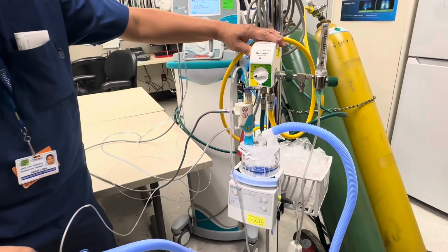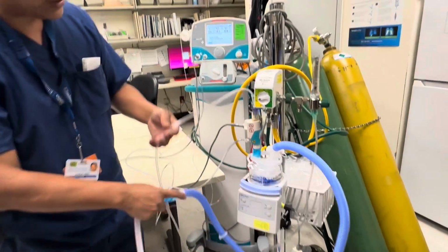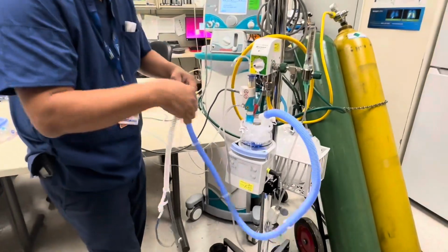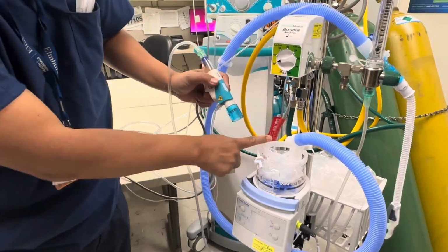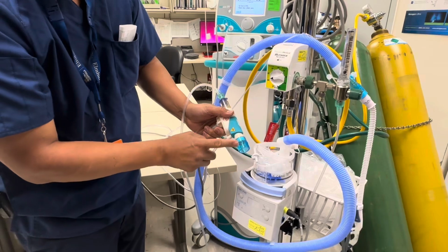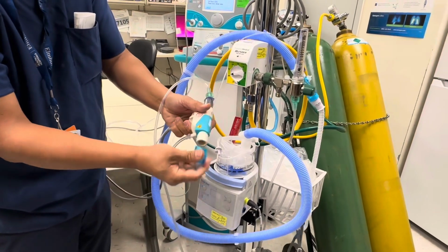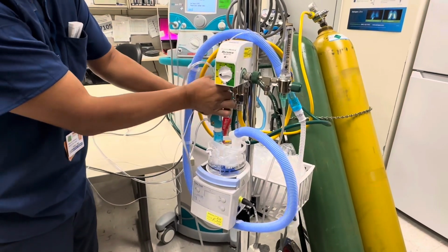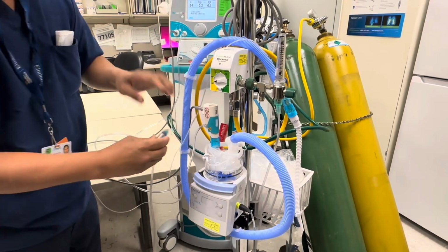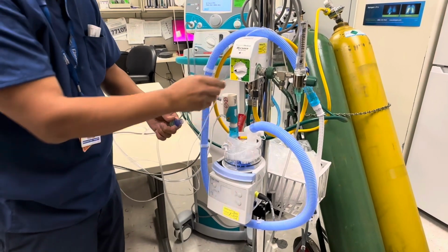The module, the way it's set up, is similar to a ventilator. So the way we do it is, okay, you have this. You need another 22 millimeter adapter, and that goes straight to the injector module. It goes right here, and then you need a 15 millimeter adapter goes here.